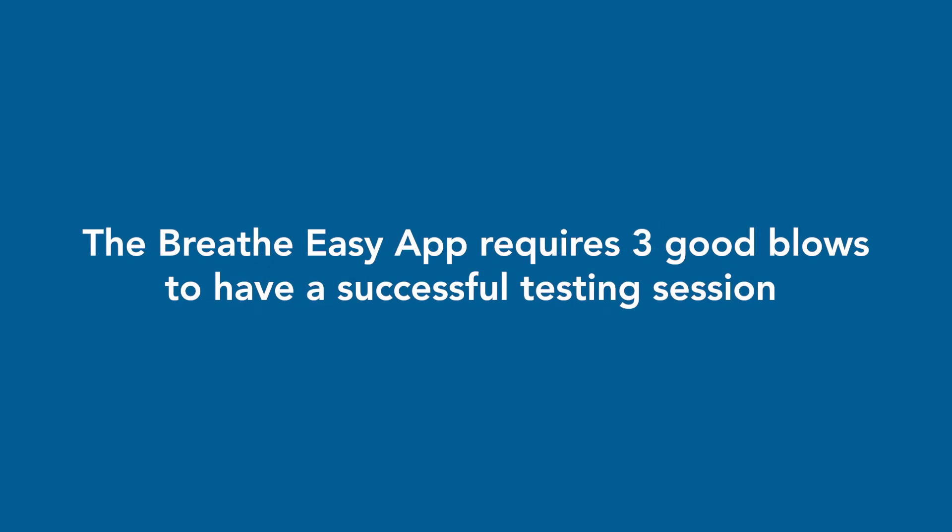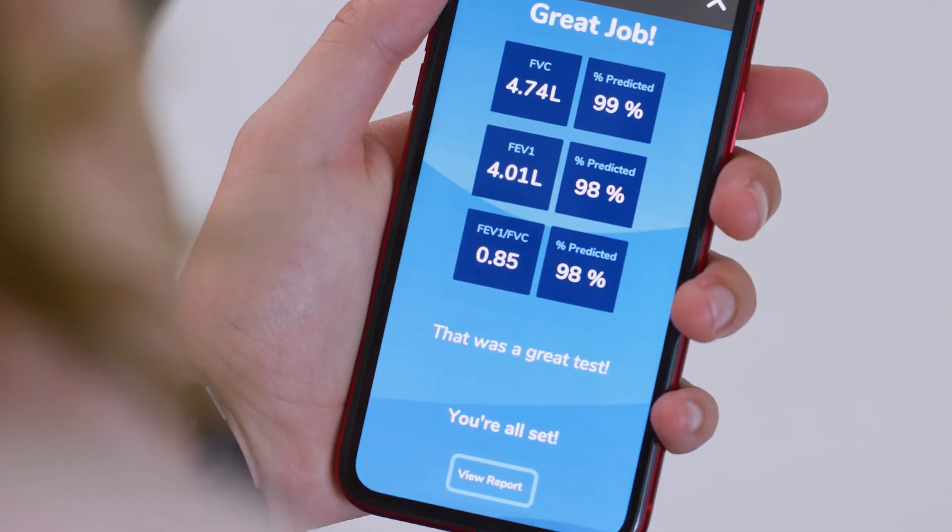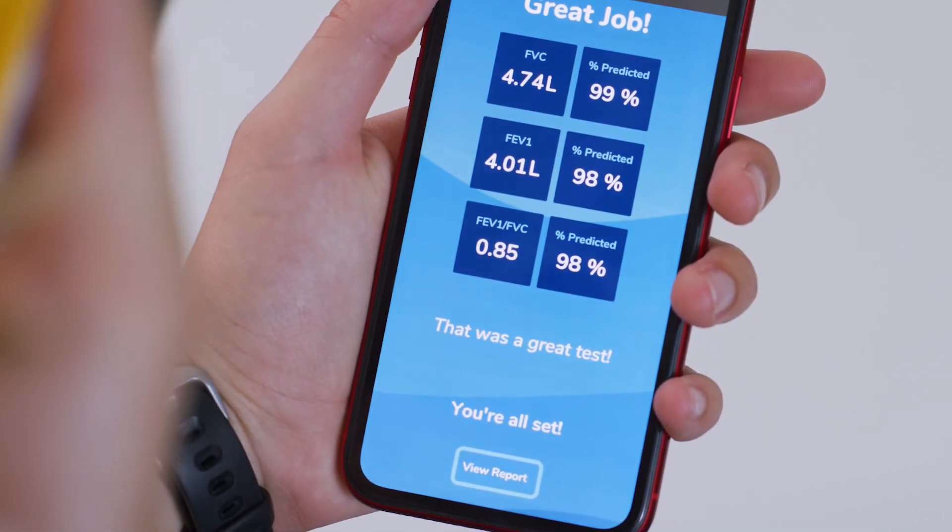You need at least three good blows to be done with the testing session. And as you know from clinic, it can be hard to get a good effort, so it's common to have to do more than three. You may be asked to do up to eight times to get three good blows. The app will let you know when you have done enough efforts, but please be sure to do at least three blows.